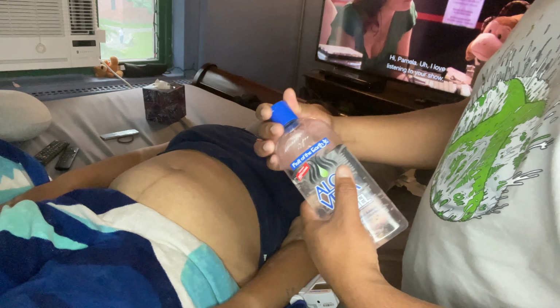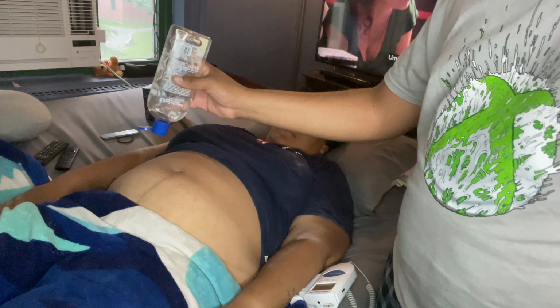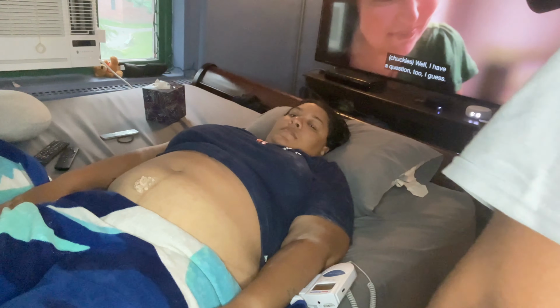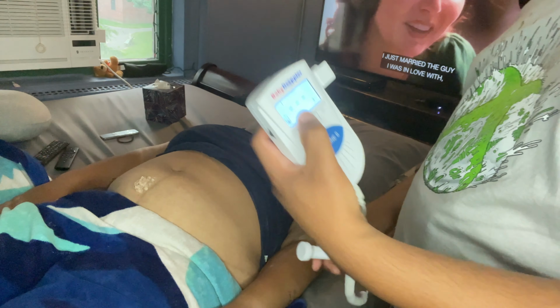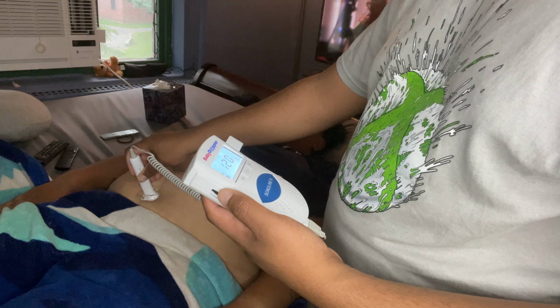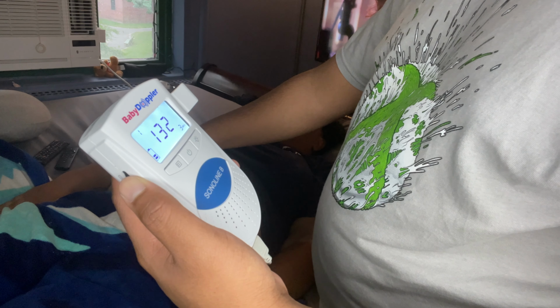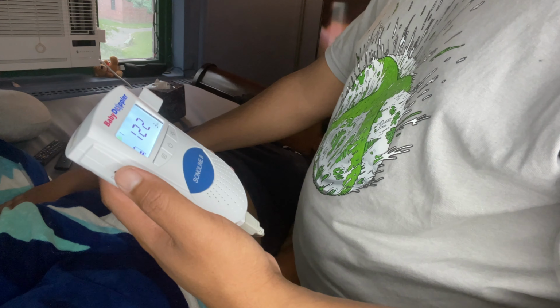So we're gonna put some of this aloe. Squeeze right here. Depending on how far along your significant other is, it depends. That should be enough. Not too much, but enough. Then obviously you're gonna take the Doppler and turn it on. It gives you a nice little indicator light. Right now, this is the baby's heartbeat. This is the baby's heartbeat, guys.